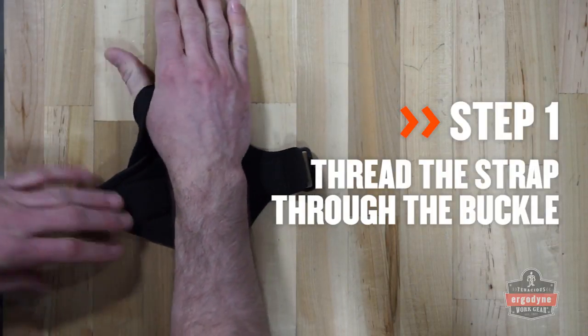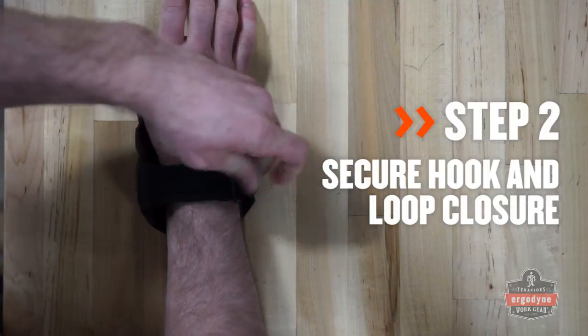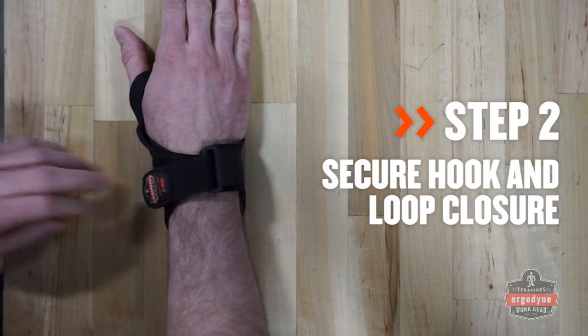To properly wear the 4020 wrist support, thread the strap through the buckle and secure the hook and loop closure at the back of the hand.